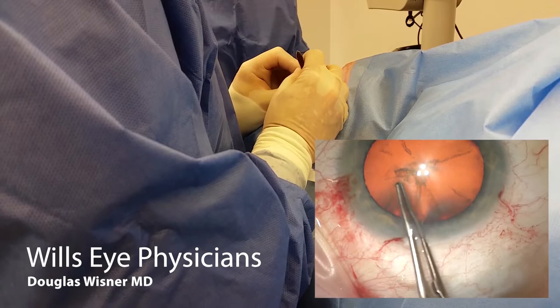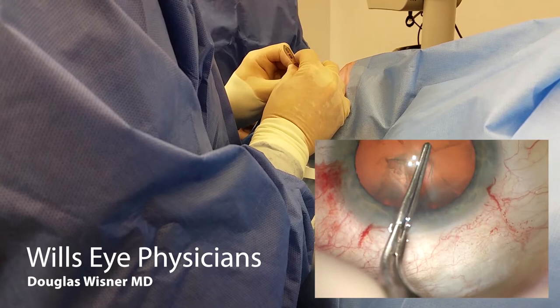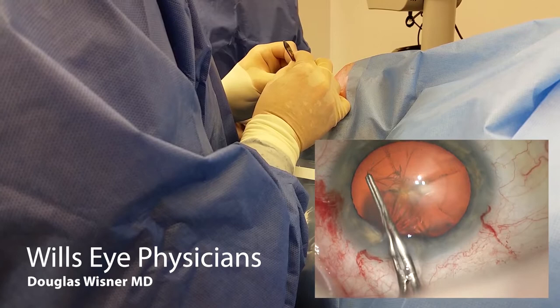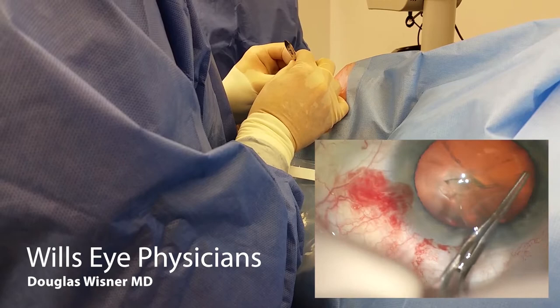Here I'm using a pair of Utrata forceps to grab that flap. I'm going to pull down, rotate in the wound, and twist in the wound to take maximum advantage. Then draw the flap centrally to reset it before I re-grab, because I want to put the edge of the flap up towards me. I'm aiming for about a 5.5 to 5.75mm rhexis. In experienced hands, usually 3 to 4 grabs is all that's necessary to complete the rhexis.